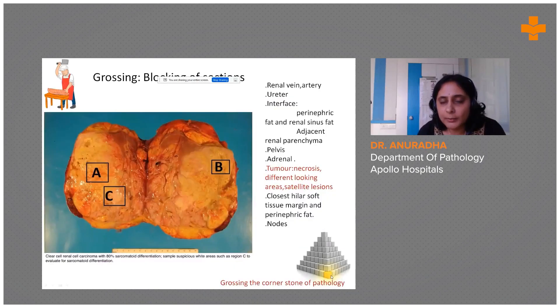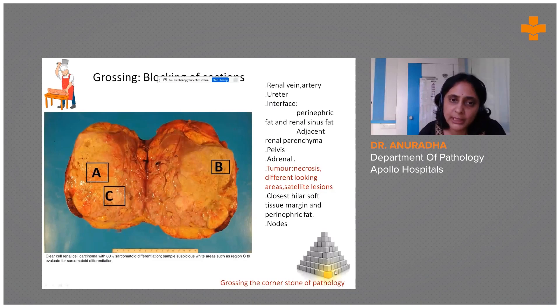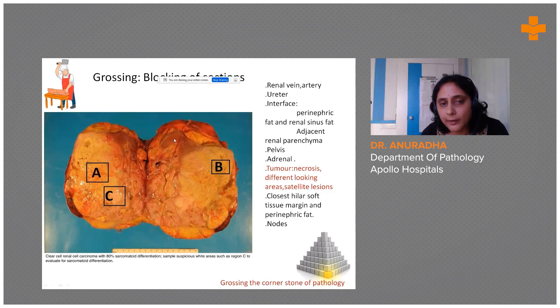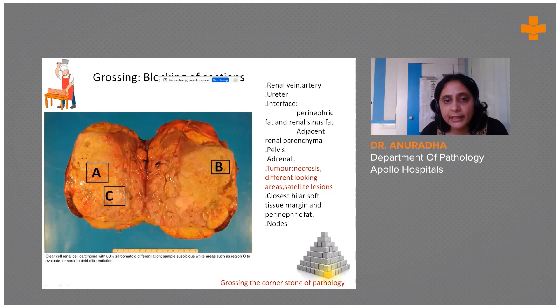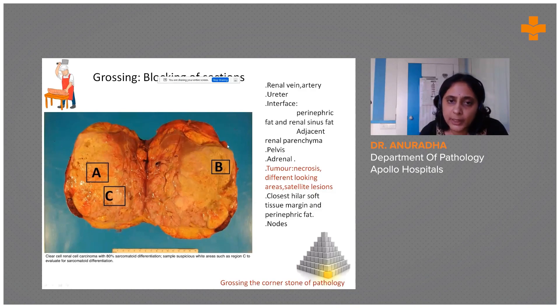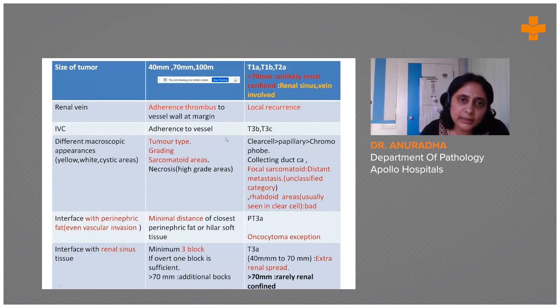Grossing is the cornerstone for pathology. For the benefit of students, I would like to emphasize the importance of blocking of sections. We typically take sections from the ureter, renal vessels, hilar vessel cut margin, interface with the perinephric fat, interface with the renal sinus, ureters, any nodes, and the adrenal.